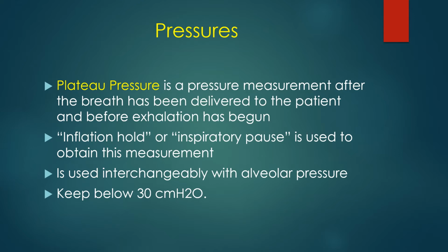He might be becoming fluid overloaded, he could be developing atelectasis, he could have more consolidation. A lot of things that could be, but we need to notice that it's trending that way, and then try to figure out what the problem is. You might want to look at the X-ray, talk to the doctor, figure out why the alveolar pressure is increasing.